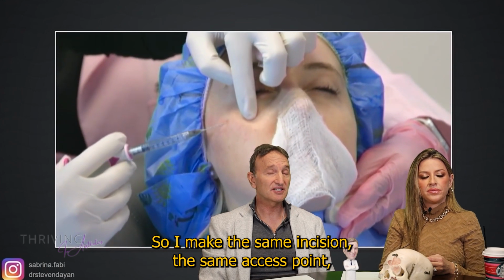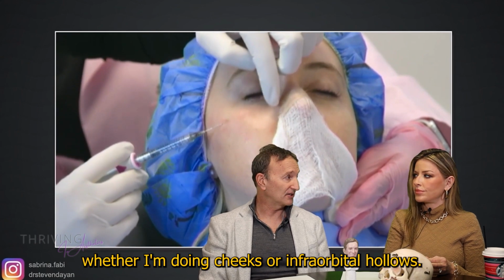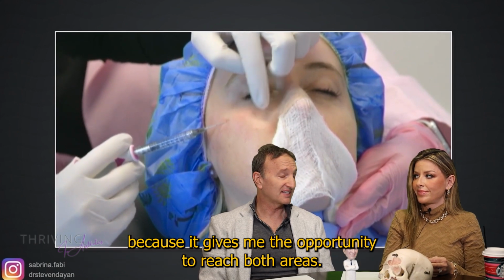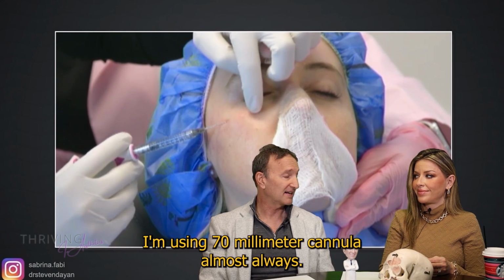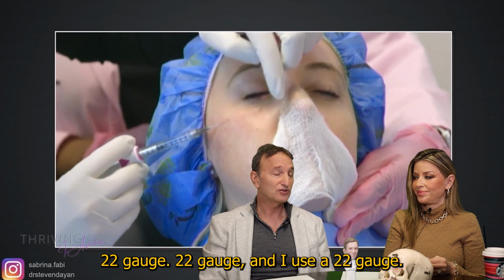Okay, so I make the same incision, the same access point whether I'm doing cheeks or infraorbital hollows. And I like that access point because it gives me the opportunity to reach both areas. I'm using a 70 millimeter cannula almost always. 22 gauge? 22 gauge, and I used a 22 gauge.